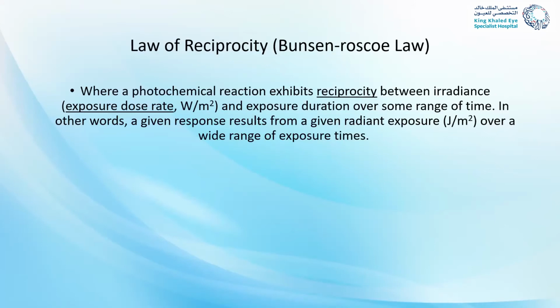Though in practicality, what many studies have found is that it doesn't really apply all the time. Sometimes the expected effect that you assume will happen doesn't work the way this law suggests. But in general, this is the law of reciprocity, and this is why you have these three main forms of epithelial off techniques. It's a matter of adjusting irradiance, amount of power, and time and duration, and how we manipulate all of this to get results.